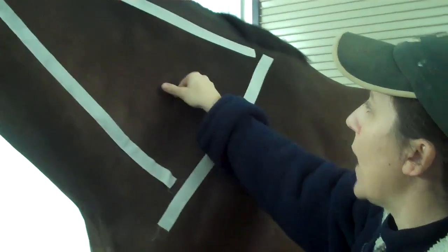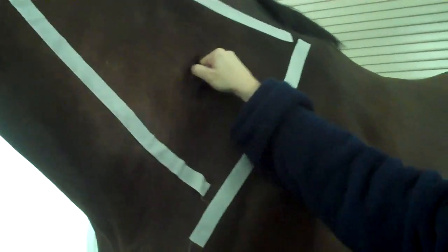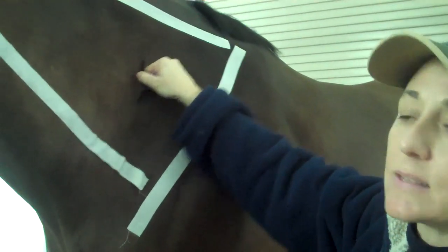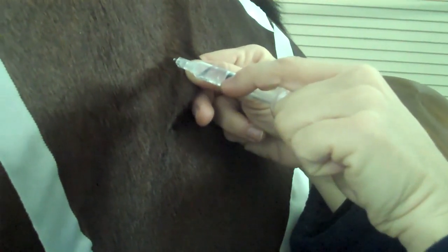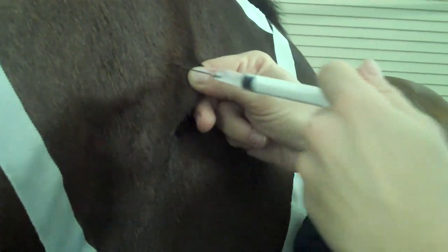To demonstrate: once the area is dry, I pinch the skin, which acts as a little diversion to the horse so he doesn't feel the shot as much. I take the needle and go right in front of that pinch. I always pull back looking for blood. If you see blood, switch sides. If I don't see blood, I inject, pull out, and then let the skin go.